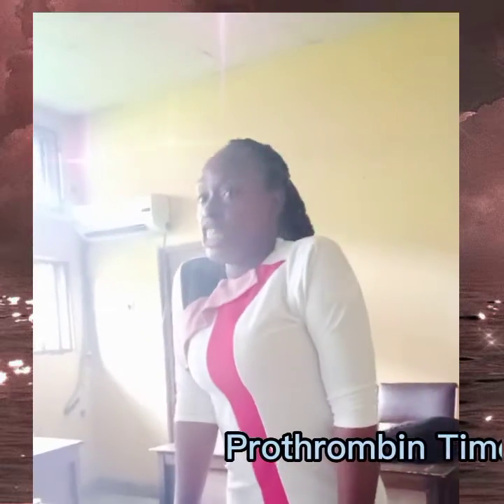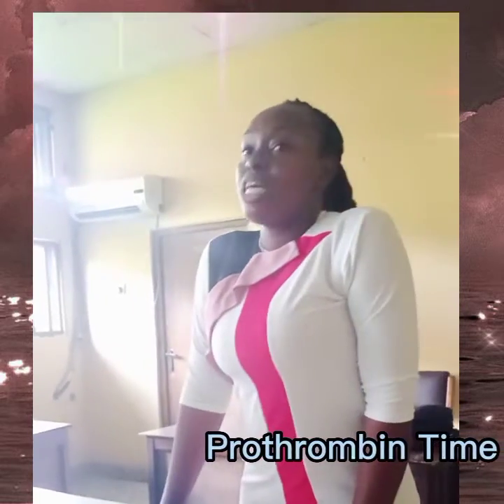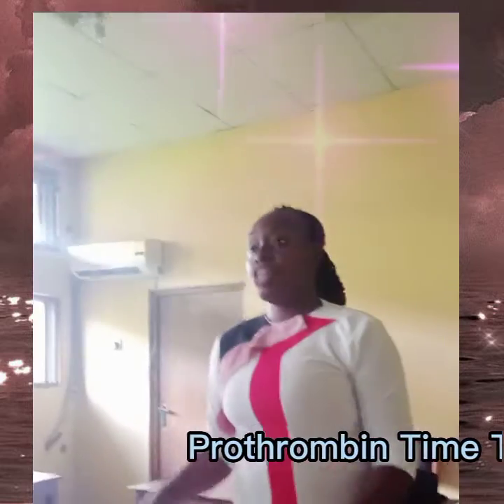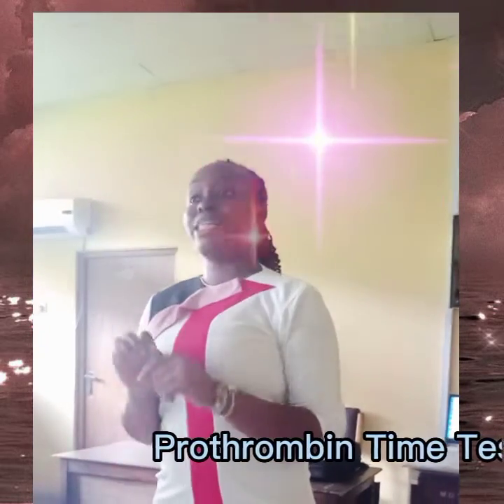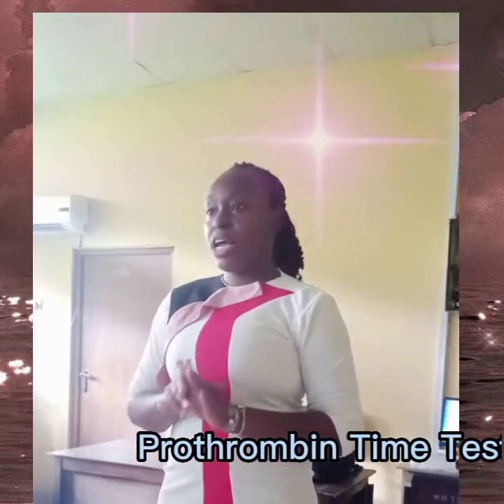So what is the aim of this test? The aim is to determine clotting time of a given plasma or to screen for the effectiveness of the extrinsic pathway. So what is the principle behind this test?